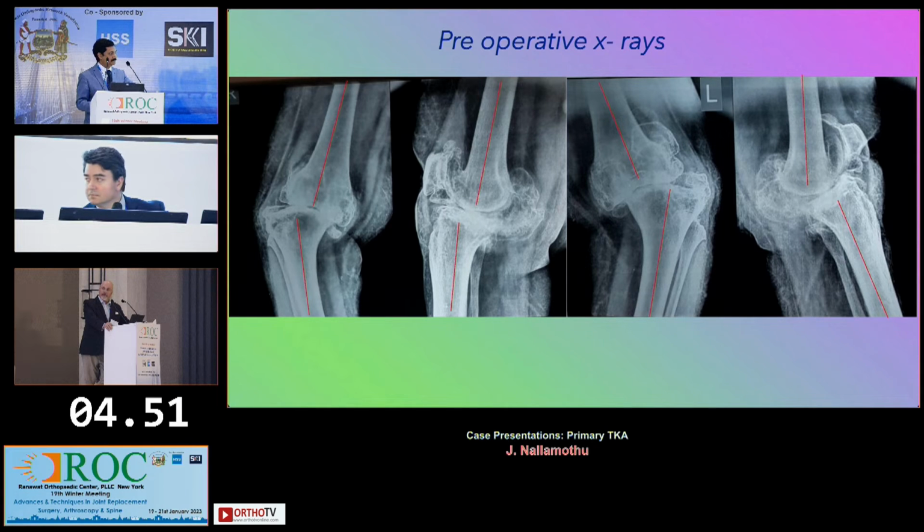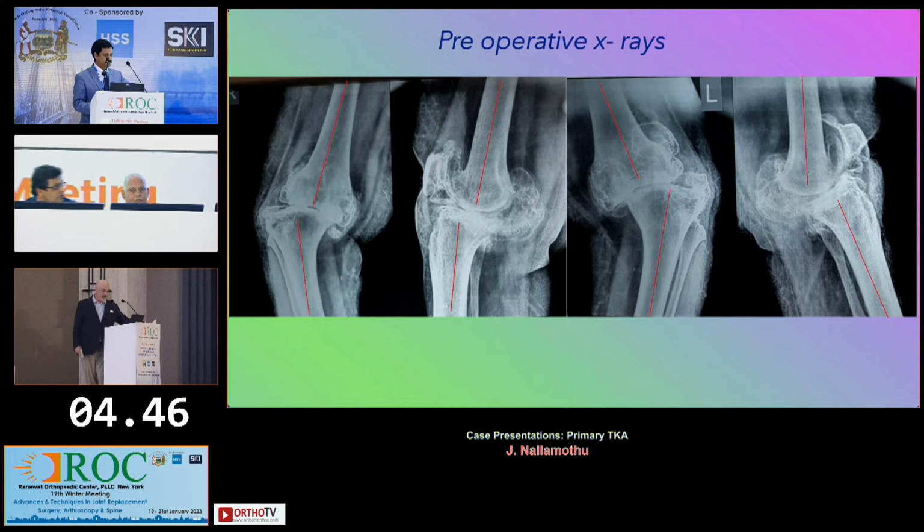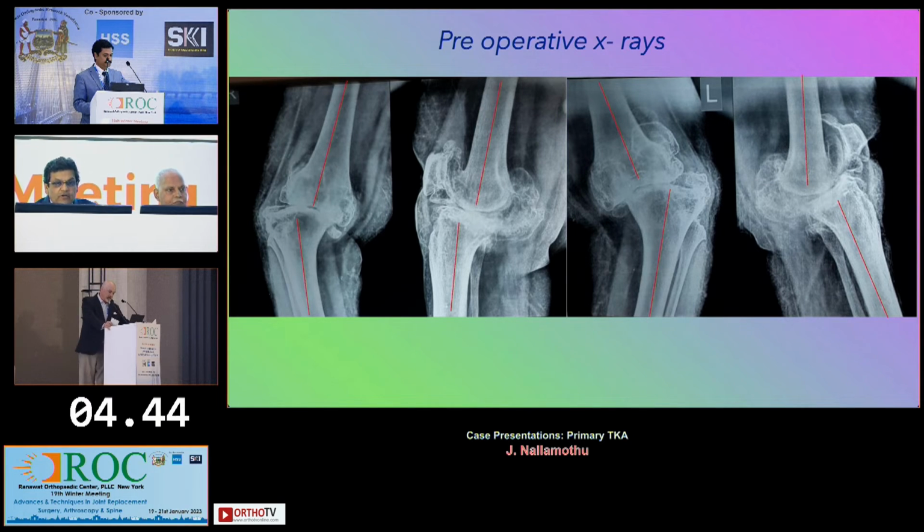What I was mentioning earlier, there is a tremendous amount of flattening of the condyle here, which is causing that hyperextension. And I think the cut you're going to need on the femur is going to be hardly any.